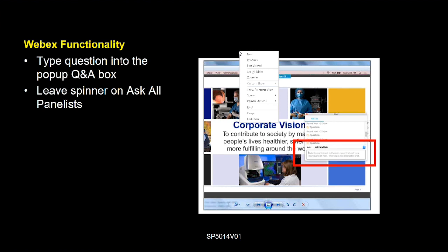It does happen, and you have to make a recommendation about when the patient should come back for their next examination. Certainly, if I retrieve it, it goes to histopathology. But if I have to, I go back and review my picture and what I thought and how confident I was in my assessment. Sometimes there are other adenomas and polyps that you have gotten, so you can know a little better about when to bring them back.